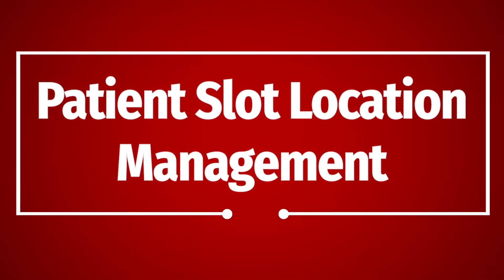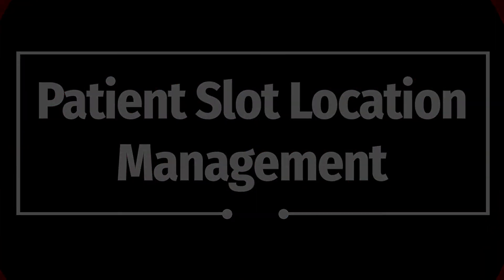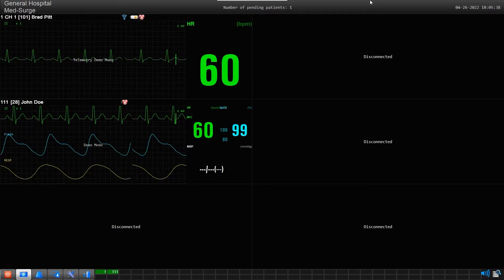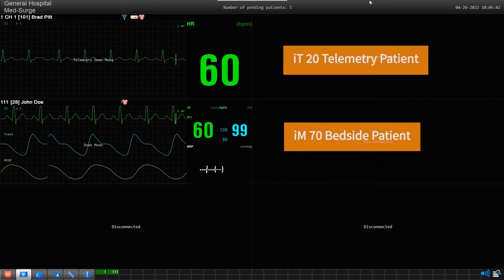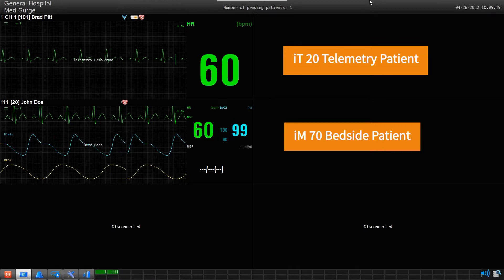Patient Slot Location Management: The location you choose to display patients on the screen is your choice and totally customizable by you. For example, I currently have two patients admitted to the screen.